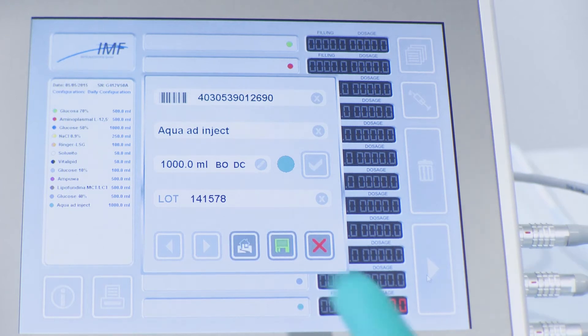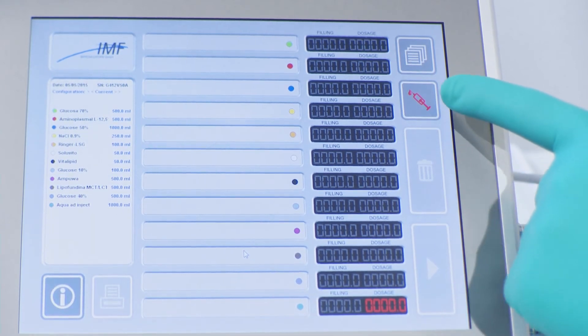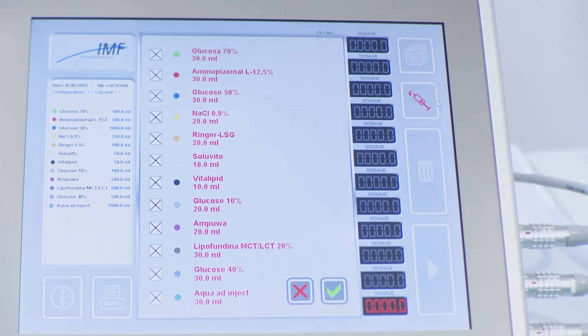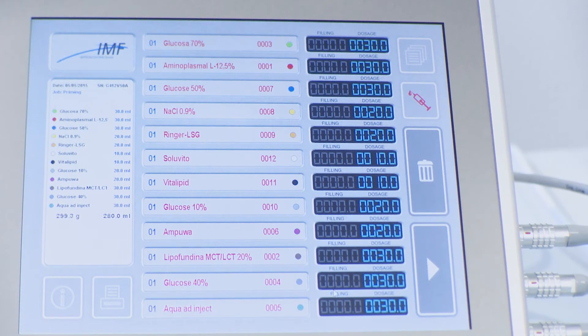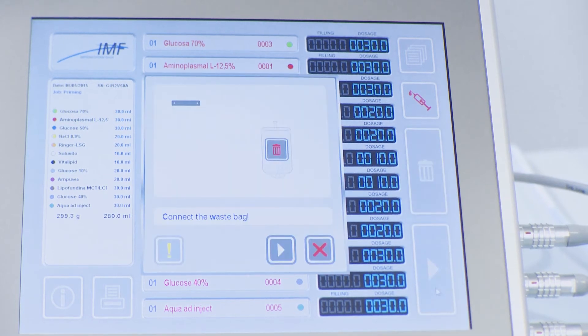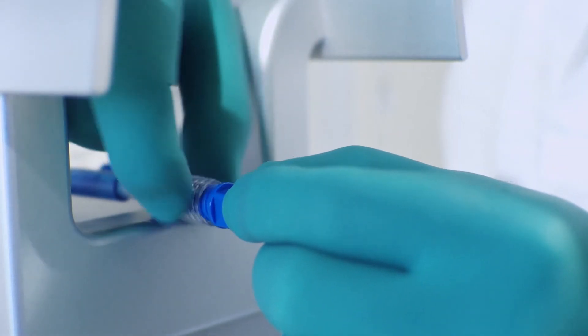When all ingredients are connected and verified, the operator can confirm the setup is completed correctly. This will allow the display of another button for the procedure of priming for all the lines used on the Medimix multi-compounder. Press the button, confirm and ensure that the waste bag is attached to the Medimix multi-compounder.